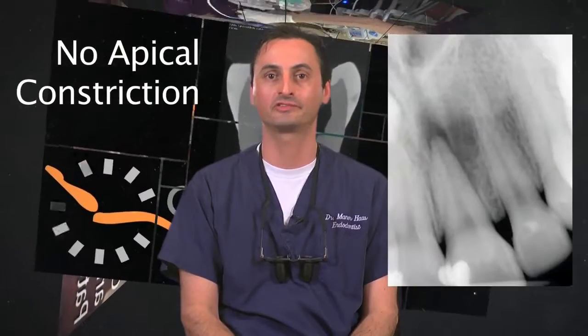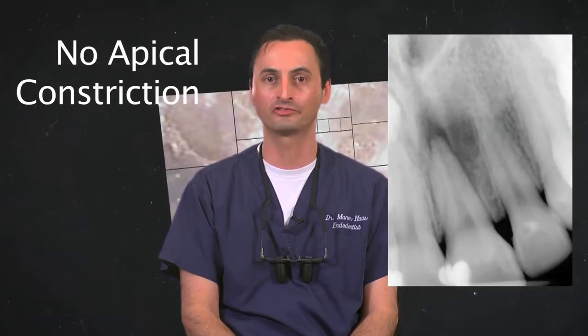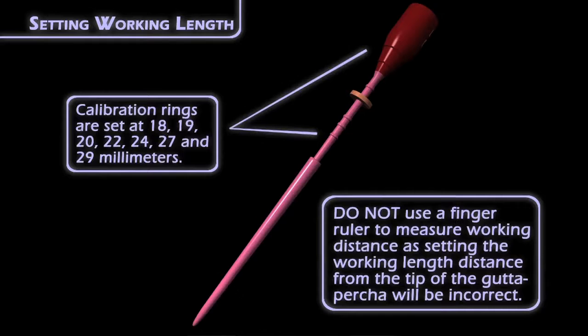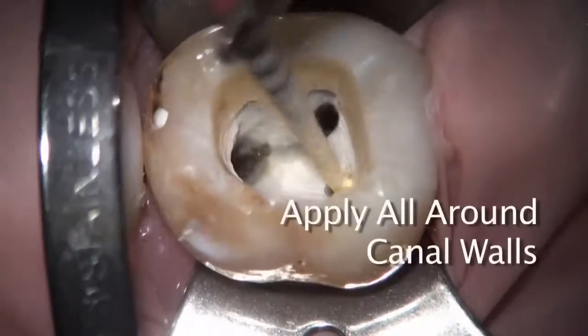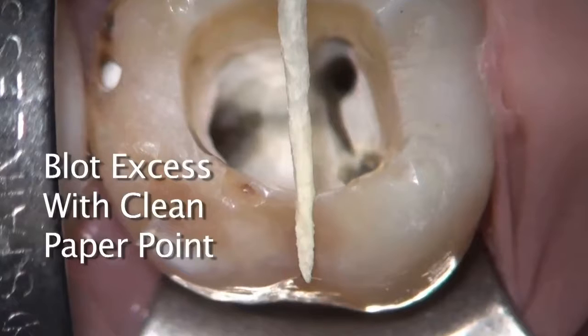Second, I'll speak about canals with no apical constriction. These include, but are not limited to, cases with apical pathology or canals you know have been instrumented large beyond the apex. In such cases, I recommend that you obturate at least 1 millimeter short of your working length. And remember to use very little sealer in these canals. This will help reduce extrusion of sealer and/or gutta-percha.